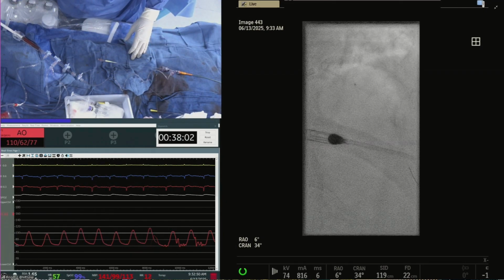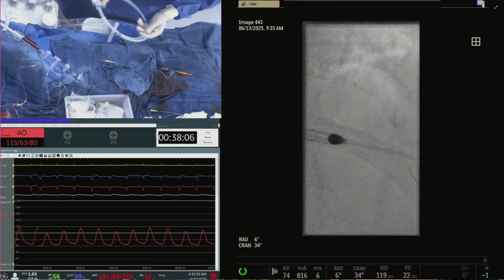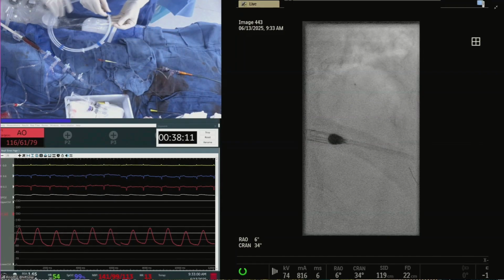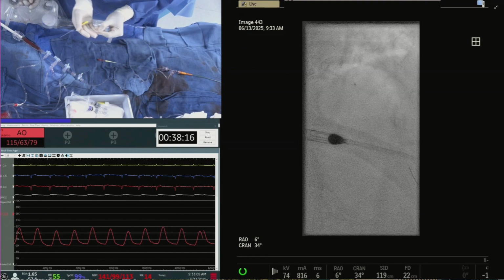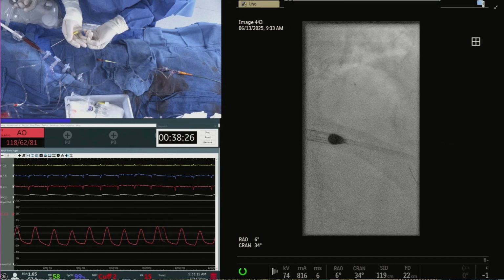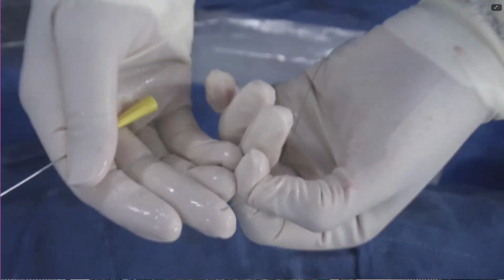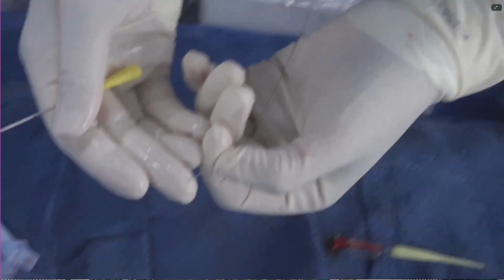So tell us, Dr. Kinney, what you're thinking. So with the Gaia, a better manipulation. The Gaia that I have is tapered. If we can show all these wires on the side, Andrew is there. If you see here, it's a tapered, hydrophilic tip. It comes from the Asahi CTO wires. X-strand is the technology that is made, which is why 1-to-1 torque is very good. Can you see it? Yes, we see it.